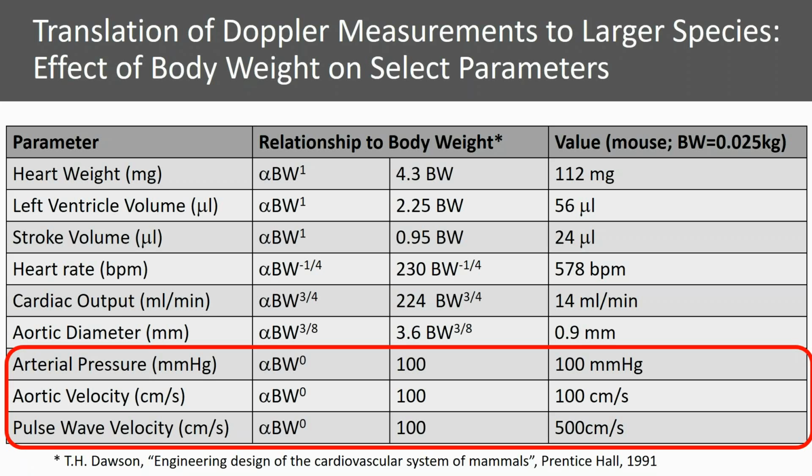Okay, thank you, Tanya. Hello, everybody. One of the questions I want to talk about on this slide, and one of the questions that constantly arises, is why do we need Doppler flow velocity? And shouldn't we be measuring cardiac output or something like that? So here is the table that explains some of that question, or rather answers that question.